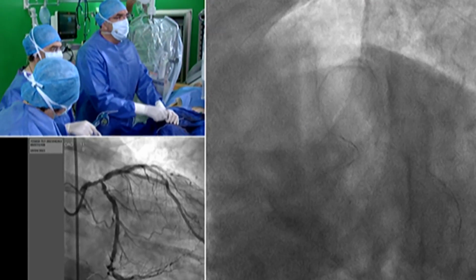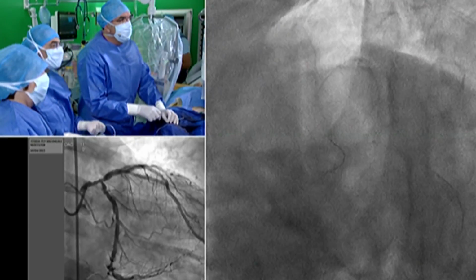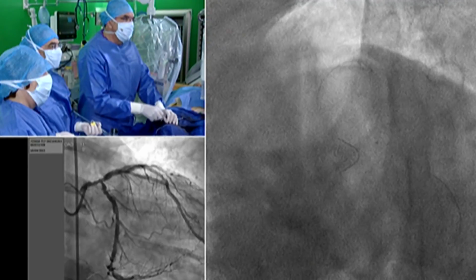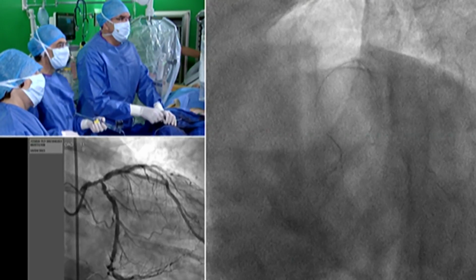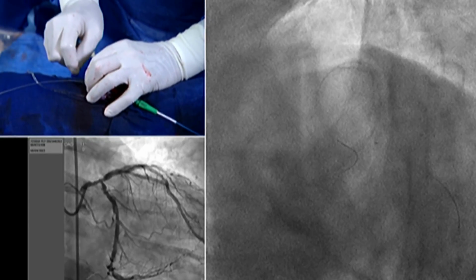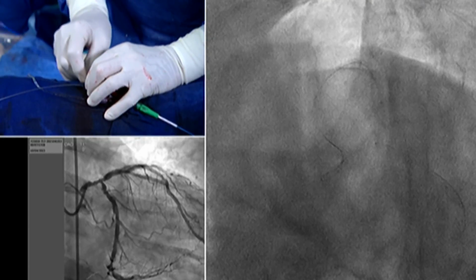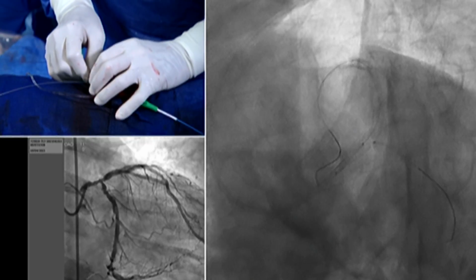You know that what we call the proximal optimization is very, very important, and this really facilitates the placement of the wire in the side branch. So I have some resistance, but it's normal because we are in 6 French guiding.